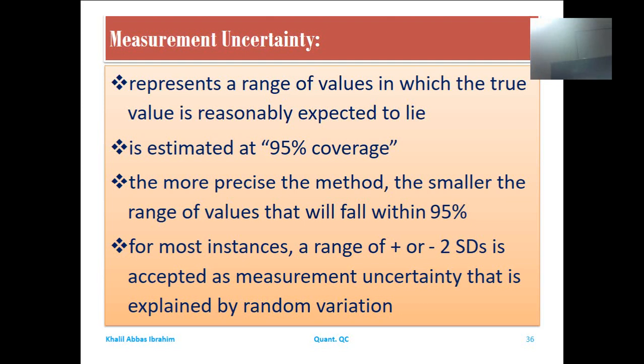Still, I can indicate the normality of the values within a range. So I will just calculate or point out a range within which the true value is expected to lie. This process is satisfactory in a health laboratory to set the quality.